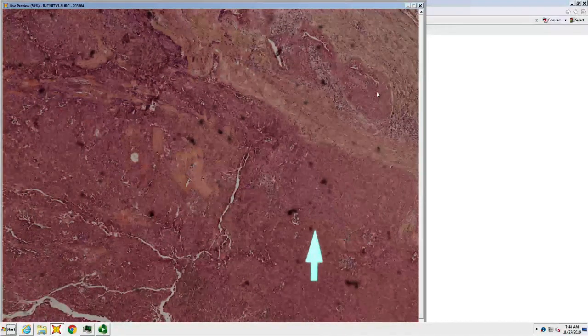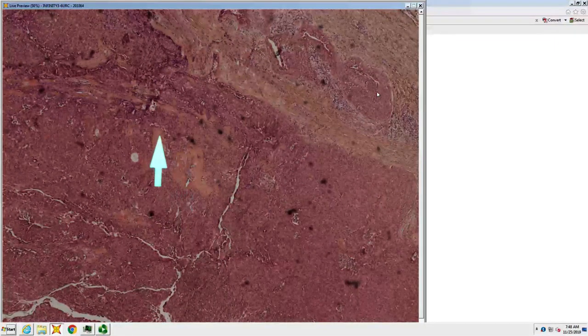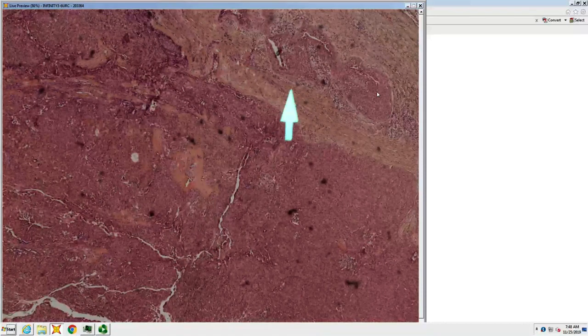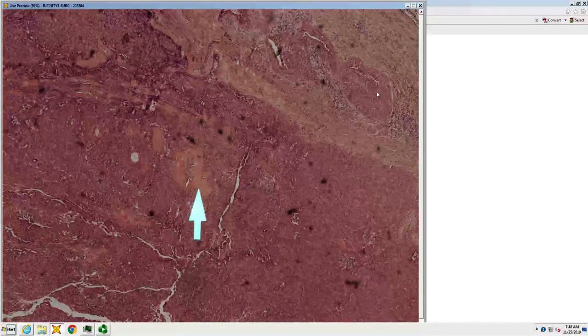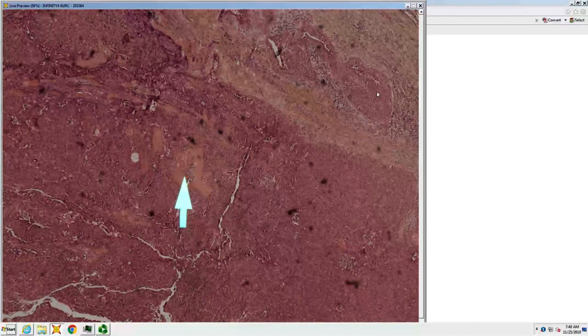So, epithelial tumor, doesn't palisade at all, has little vessels with this osteoid-like stroma around the vessels. Poroma or porocarcinoma, and given the infiltrative growth here, we're a little worried about porocarcinoma. This is characteristic, we call it poromostroma. It looks almost like osteoid, but with little vessels in the middle, and it's a million wraps of basement membrane zone material.